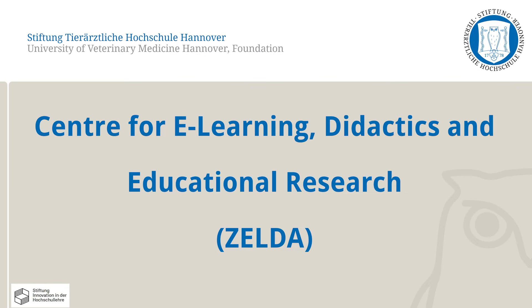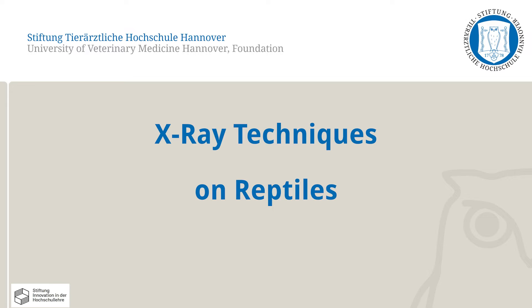In this video, the Center for E-Learning, Didactics and Educational Research at the University of Veterinary Medicine, Hanover, will present the x-ray techniques used on reptiles, demonstrated on the examples of snakes, turtles, and bearded dragons.